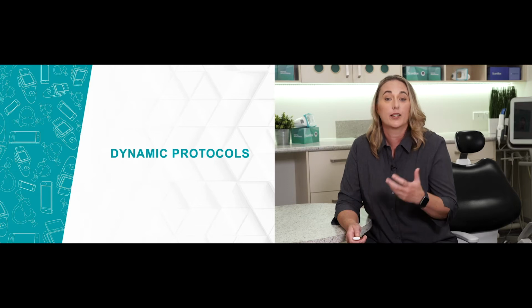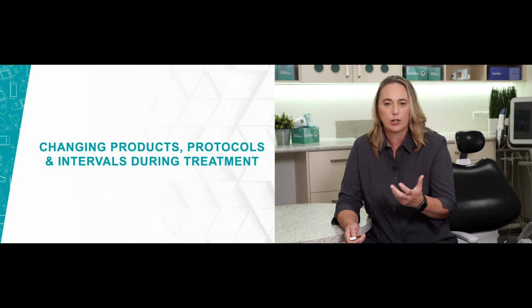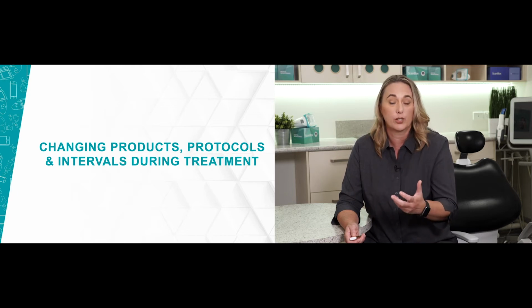And today I want to talk about dynamic protocols. And what I mean by that is when we change our protocols, our products and our intervals during treatment to get the most out of dental monitoring for our patients. So our protocols are the template of the rule set for patient management, and they tell DM what to do, they tell the patient what to do, and they tell our staff what to do.